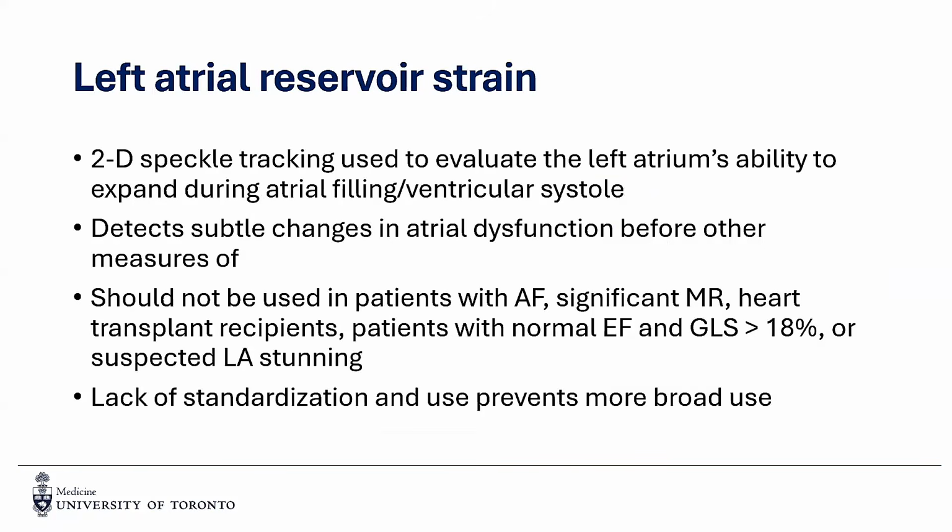If we go back to the Wiggers diagram that I presented towards the beginning of the presentation, the left ventricular systole occurs simultaneous to the slow atrial filling that happens as we go through the cardiac cycle. In general, it's thought to represent a direct measure of atrial compliance, looking at how well the atrium is able to accommodate pulmonary venous flow while the mitral valve is closed.